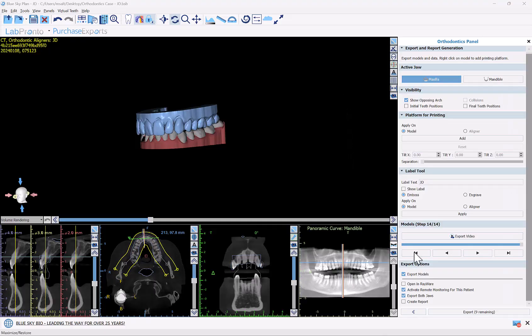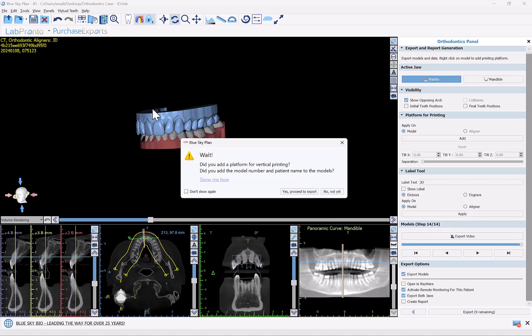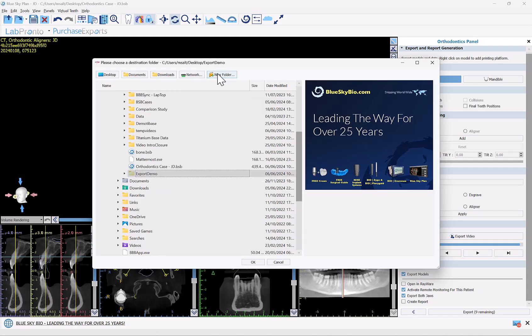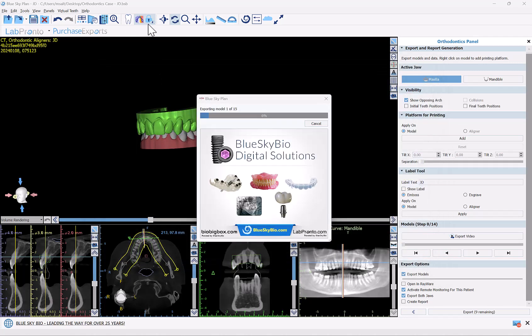Now I'm going to click the export button. The software confirms that we've completed adding any platforms for vertical printing or adding any pitch and identifier to the models. I'll click yes, proceed to export, click desktop, create a new folder, and the models are going to be exported to this new folder. The software is now running the export process to export the models to the folder.